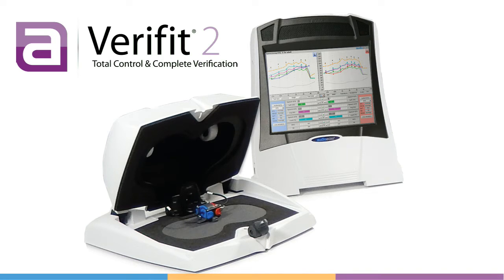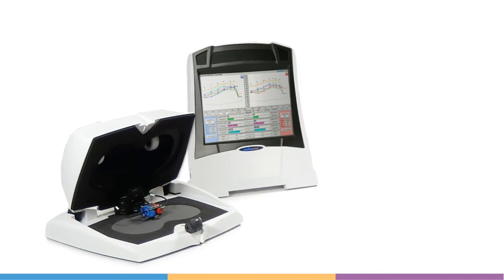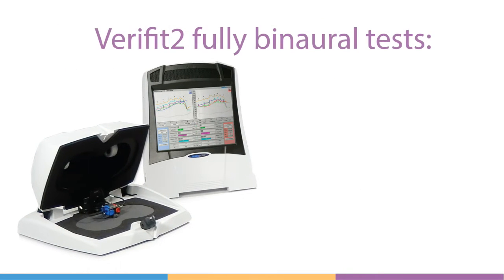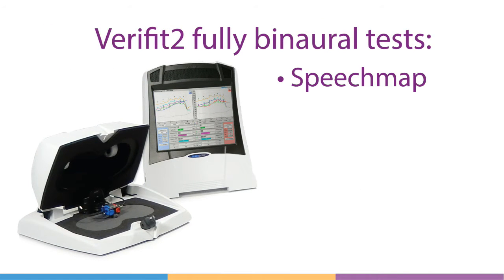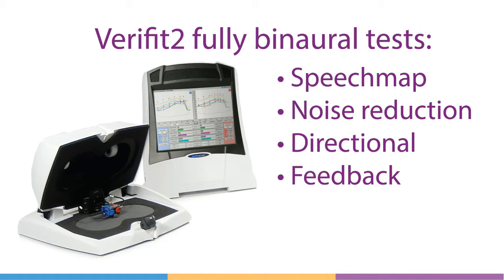The Verifit2 hearing instrument fitting system features a wide selection of tests that can be run simultaneously on two hearing instruments, both in test box mode and on ear. This video will focus on binaural speech map fitting verification.